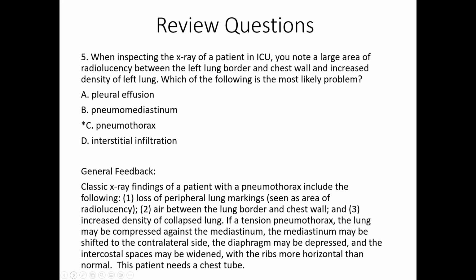The other thing I'm going to say is this, and I promise I'll go to the explanation of general feedback in a moment: pneumos can sometimes be difficult for the newbie to recognize on X-ray. What will happen is you'll see a very faint line, and we steer you towards going to reviews that are online. Some of them are free. You won't see any lung markings or interstitial markings. You'll see a faint line, and inside of that faint line there will be markings, and outside of it there are none.